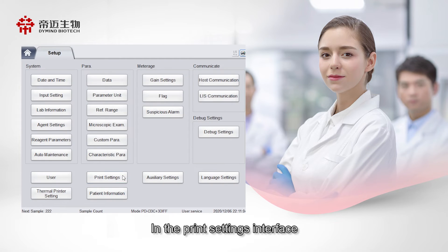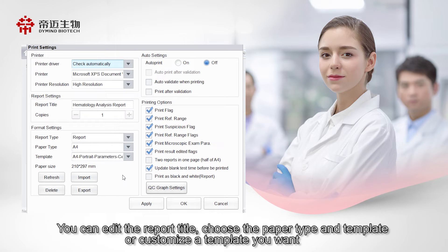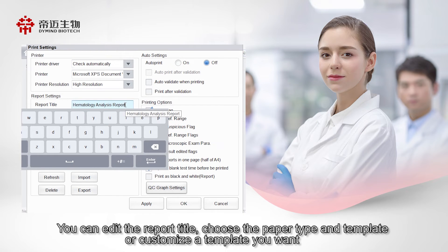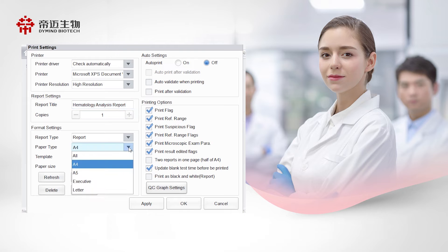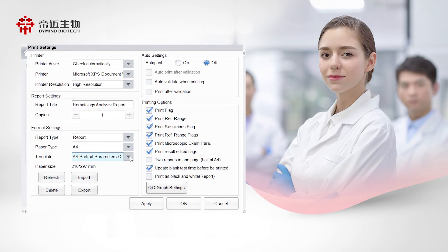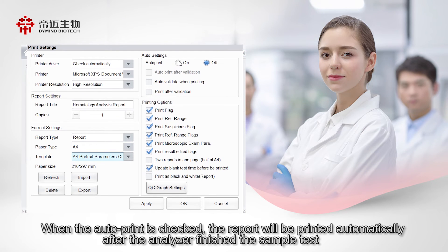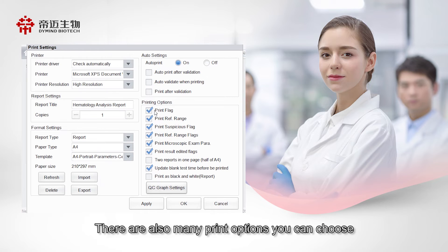In the print settings interface, you can edit the report title, choose the paper type and template, or customize the template you want. When auto-print is checked, the report will be printed automatically after the analyzer finishes the sample test. There are also many additional print options you can choose.